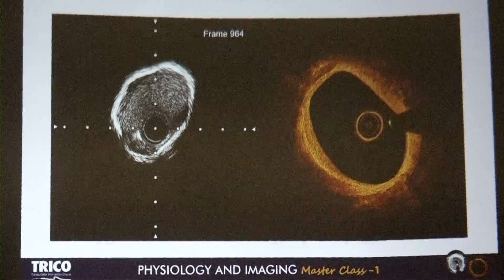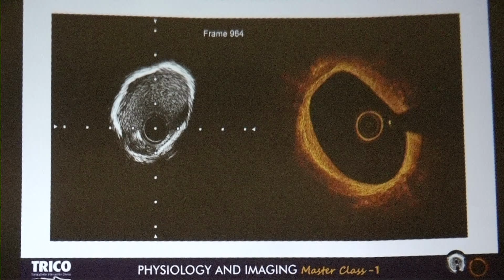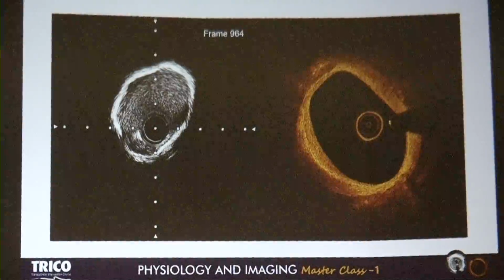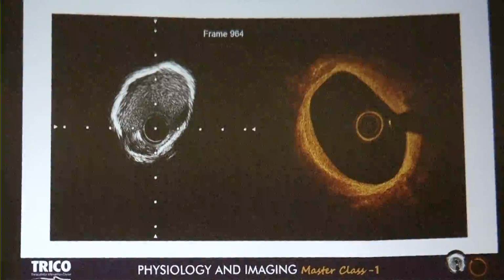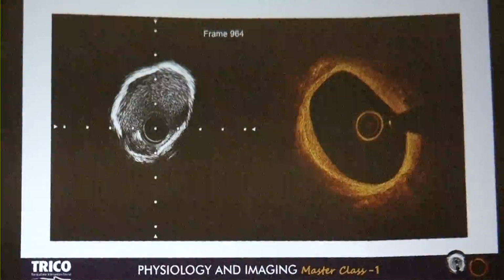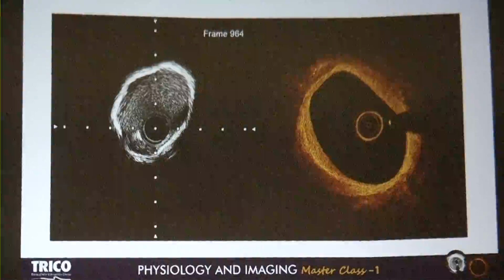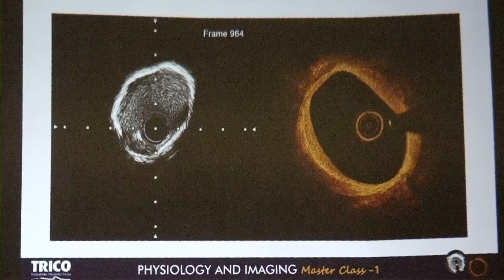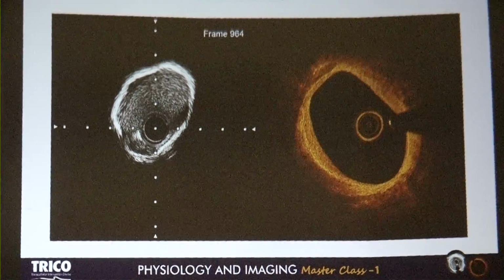Abhiram, Professor Akasaka. Yeah, there is calcium, not circular, but from 1 o'clock to 5 o'clock, and also the 6, 7 to the right. But there is some fibrotic portion there. Then here it looks like 360-degree calcium, and here it looks like a significant amount of fibrosis and calcium. So how do you interpret?